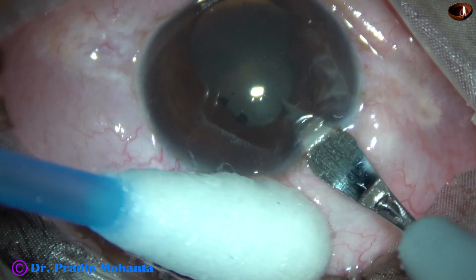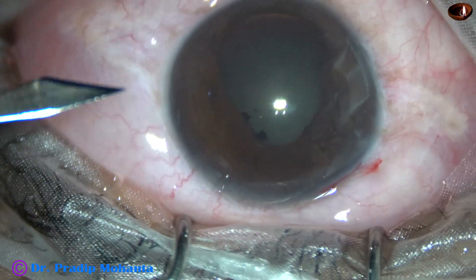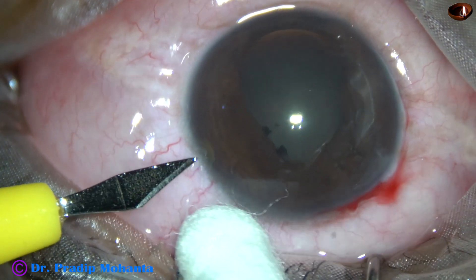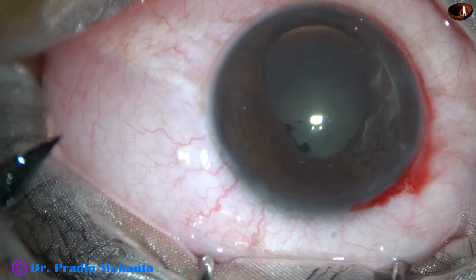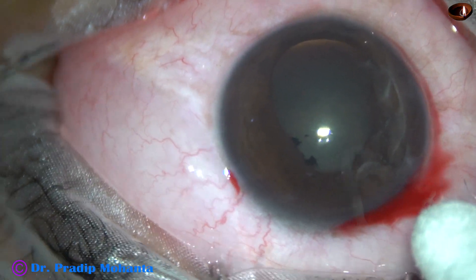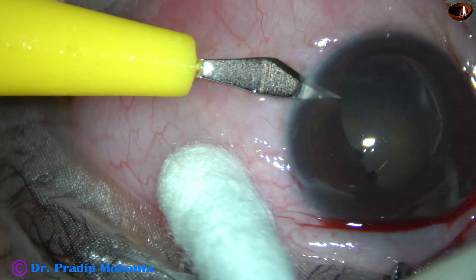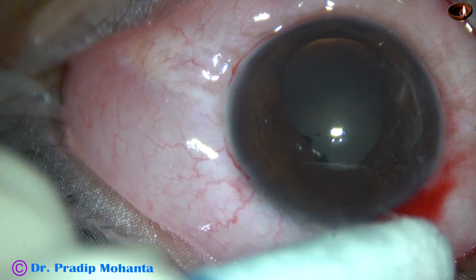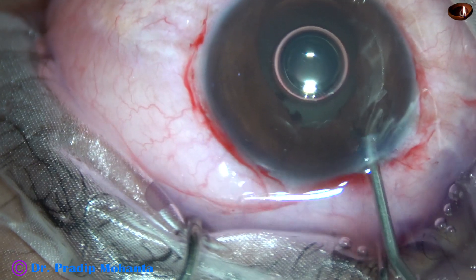This is the main incision at 11 o'clock with a 2.8 mm steel keratome. A side port is being made at 2 o'clock. Now I make some stab incisions — I want to place three iris hooks in this case. A side port at 4 o'clock, another side port at 9 o'clock, and one more is made at 12:30 o'clock.